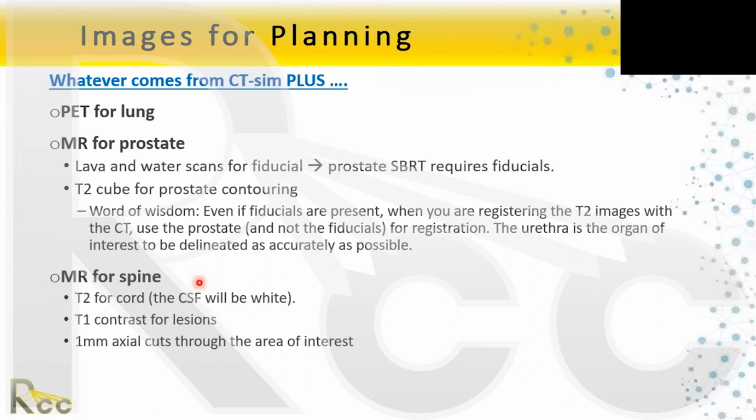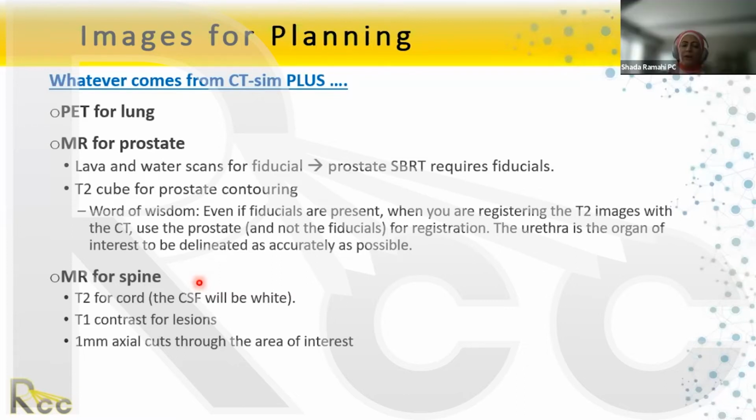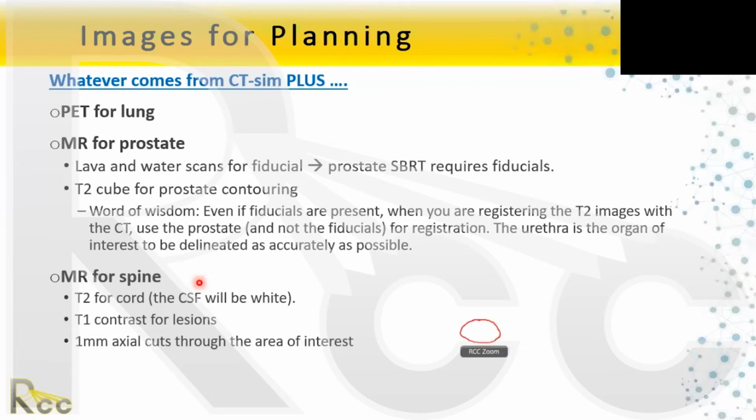Is it okay if I draw and really quickly show how I do it? Sure, go ahead. So if we have a tumor, we know we want to contour it. I begin by saying this is for a 4D CT scan. I will start by deriving the average scan, or the mean scan. And then on that scan, I'll find the tumor and contour it. That's where I start off. And this is my GTV.